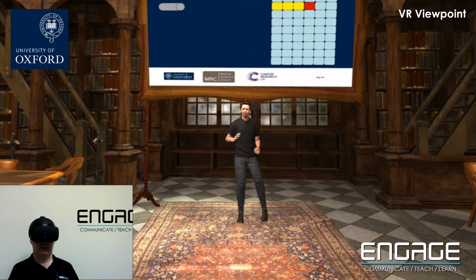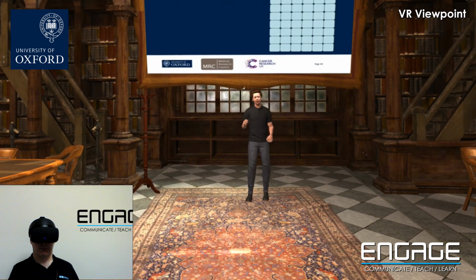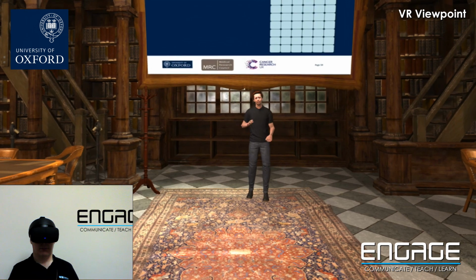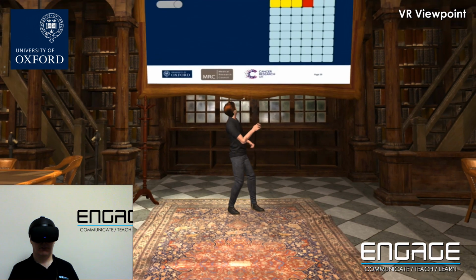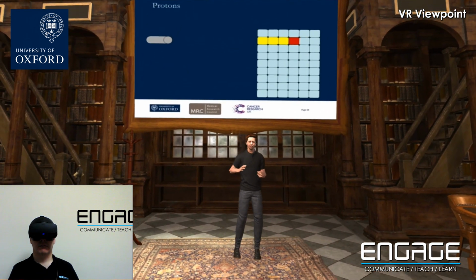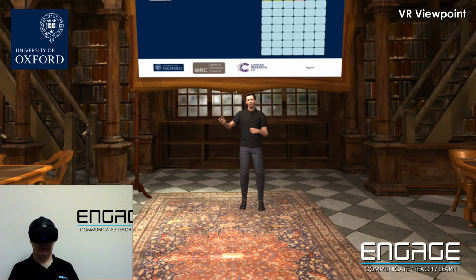The balls still travel into the patient before they drop their energy, so it's still the slightly weird physics of the small. But now we're seeing a pattern where there's a little bit of damage, a little bit of damage, a little bit of damage, a big spike of damage, and then nothing beyond. That's because these protons are flying in, doing damage as they travel, and then stopping travel.